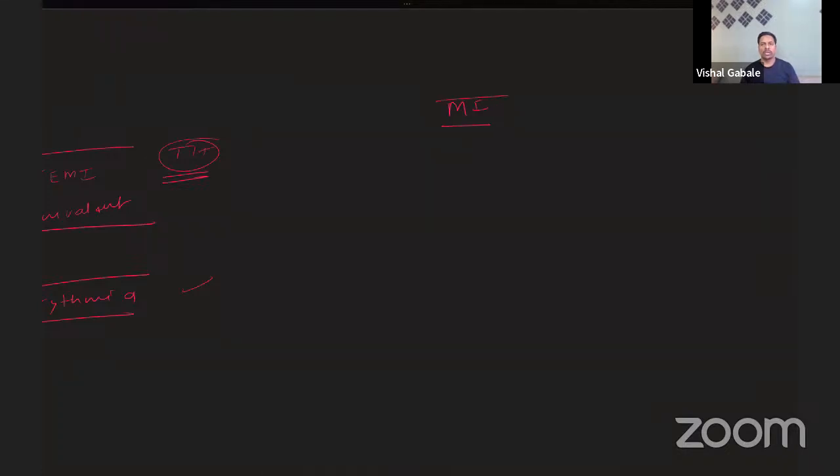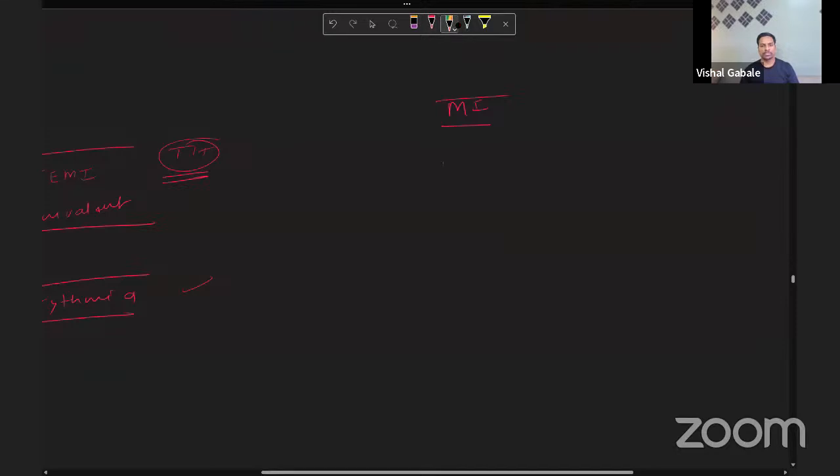We discussed the anterior wall, V2, V3, V4, V5. The inferior wall, leads 2, 3, and aVF.